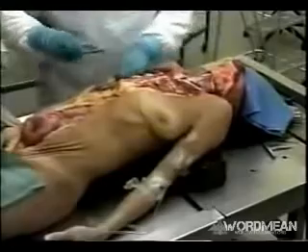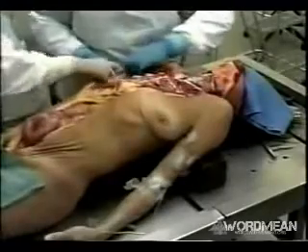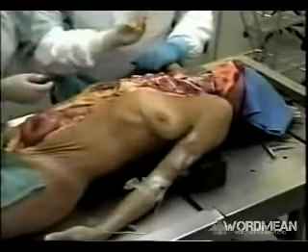What they're noticing is that this individual has had breast implants placed. They hadn't noticed the scarring earlier, so it's a little bit of a surprise. And that's a silicone implant.